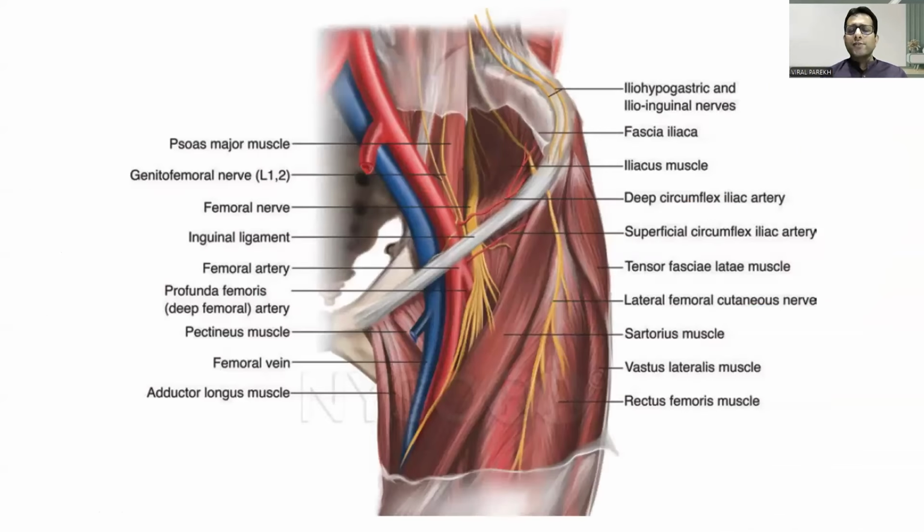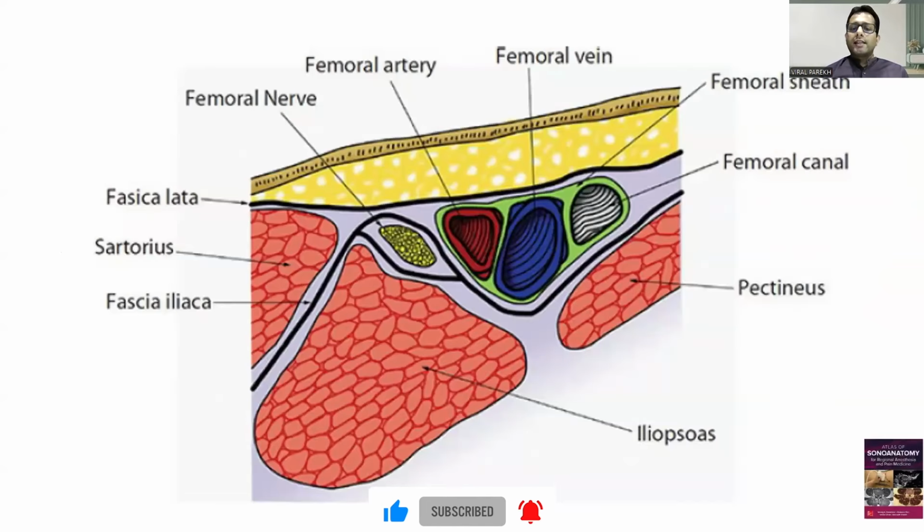and knee. So as we can see, the femoral nerve, this is the cut section, which is the thickest nerve of the lumbar plexus. And in this image, we need to understand that just below the inguinal ligament, it further divides into the anterior and the posterior division. This is the classical anatomy, the VAN arrangement, which all of us know, from medial to lateral.